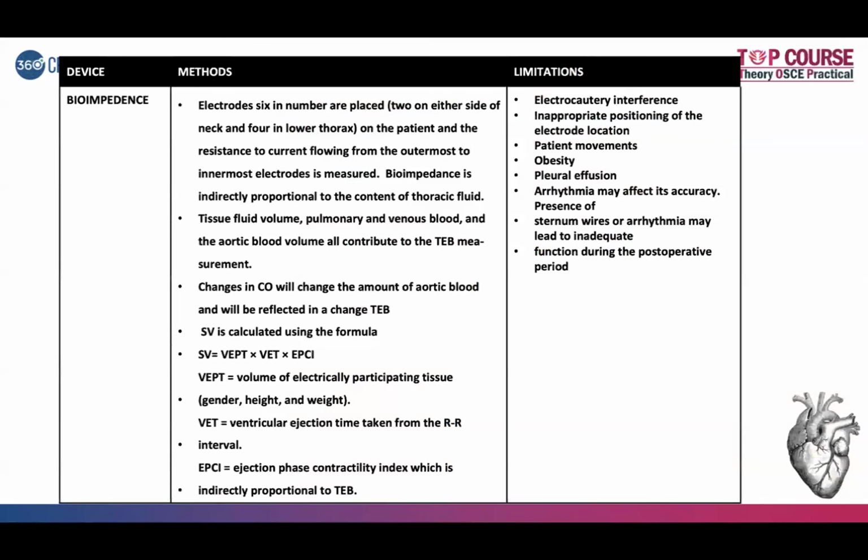Coming on to other non-invasive methods, bioimpedance, bioreactance. So both these principles are based on keeping a few electrodes on the chest, and we are seeing the lung, the heart, all as a conducting tissue. So these conducting tissues sense the motion of the blood flow within these pressure chambers, and this motion sensing is going to get detected in the electrode, which is going to reflect, using an algorithm inside the machine, and give us the cardiac output value.